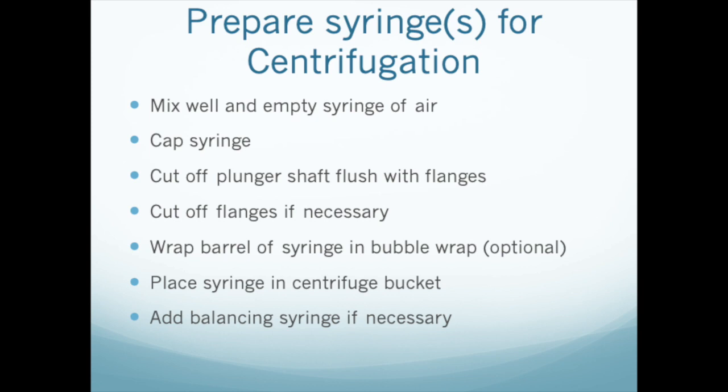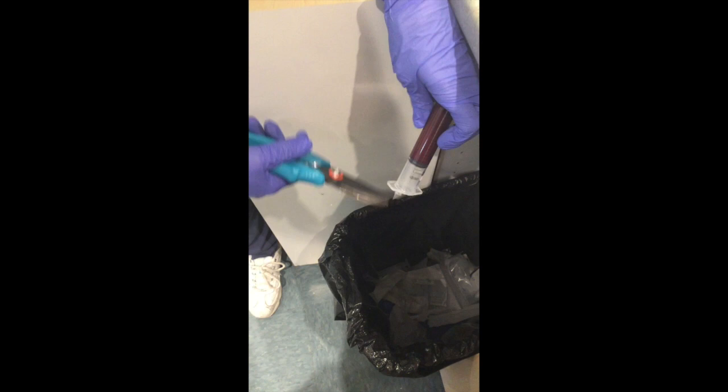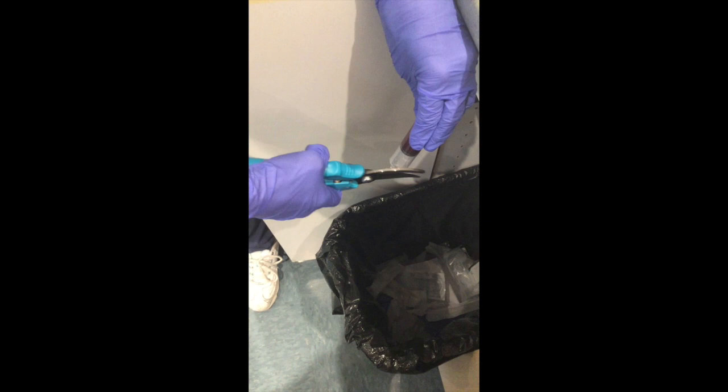Garden shears, diagonal cutters, or even tin snips will work for this. Depending on the size of your syringes and of your centrifuge buckets, you may have to cut off the flanges of the syringe as well. You may wish to keep the syringe from moving around in the bucket during centrifugation by placing it in a conical tube inside the bucket, or by wrapping the barrel in a small piece of bubble wrap or something similar before placing it into the bucket.